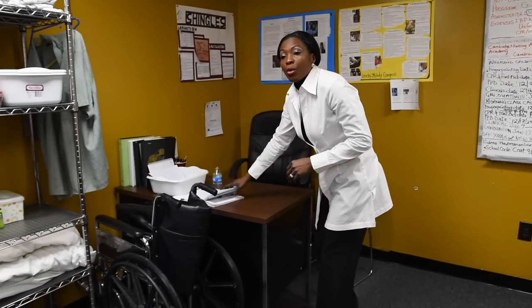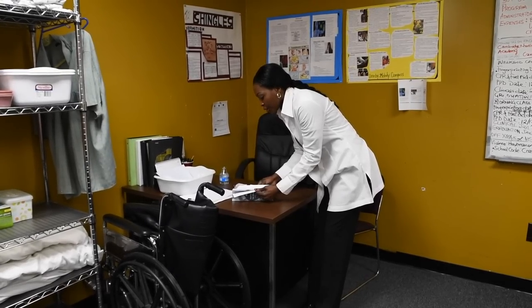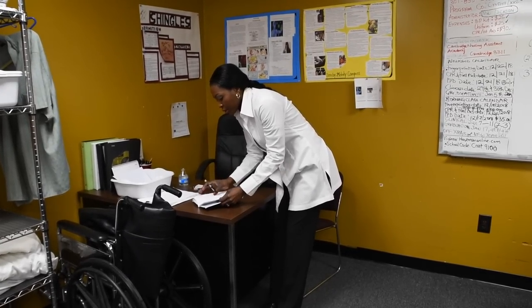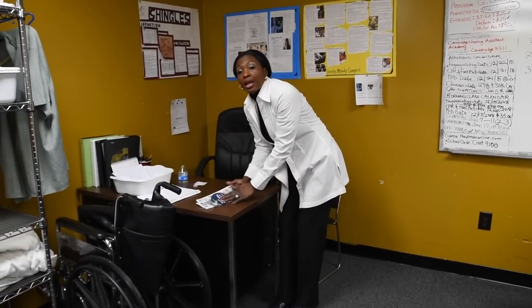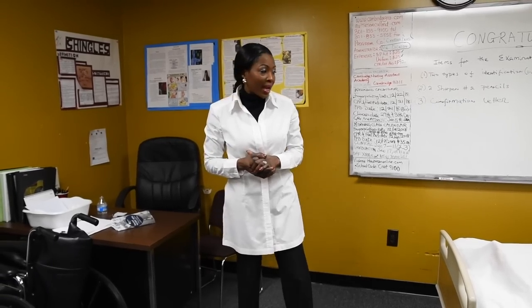Then I go to my recording sheet, and where it says blood pressure, once again, I would record. I got 90 over 60. Okay, no letters behind it. I just write it down and I give it to my patient, I mean, my examiner. You are done with the blood pressure.